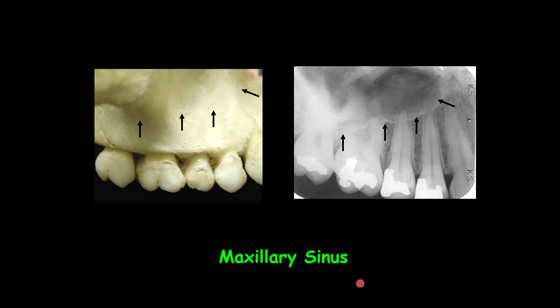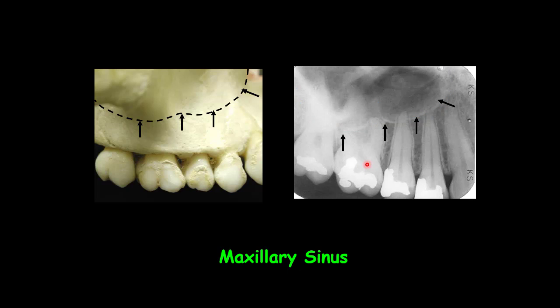The maxillary sinus is one of the paired sinuses inside the body of the maxilla. In adults, the sinus floor usually extends from the distal of the canine to the posterior wall of the maxilla. On periapical radiographs, we see the inferior border of the maxillary sinus as a thin layer of cortical bone.